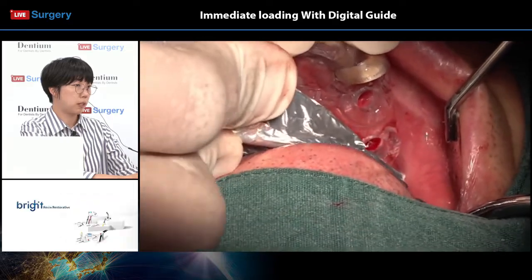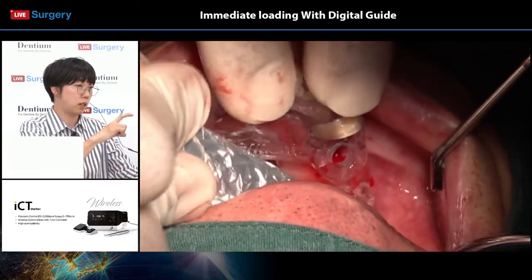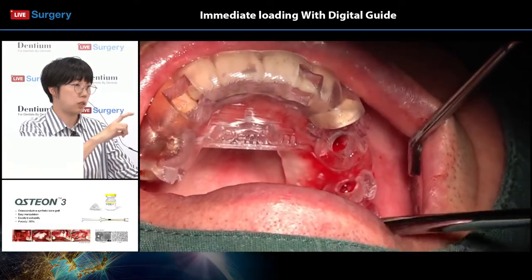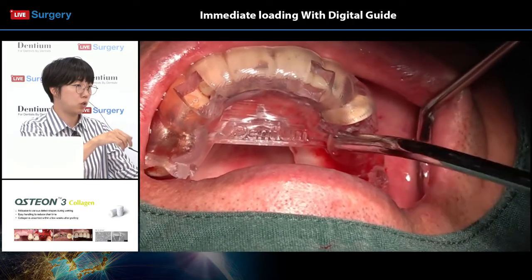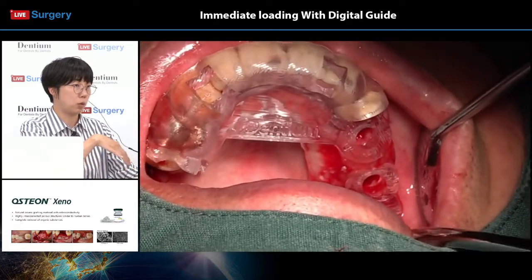And when preparing the molar areas, the instrument might be too long for the sufficient positioning, so it's always important to check that your drill isn't stuck into the opposing dentition. That is the lower molars in this case.